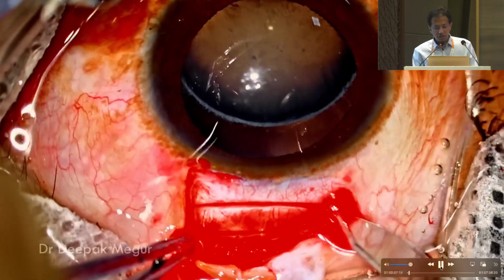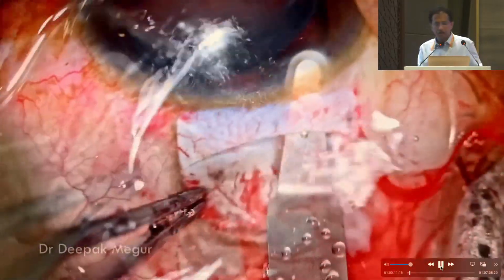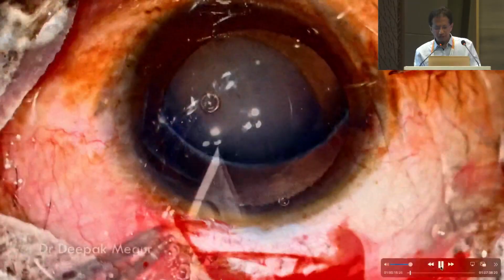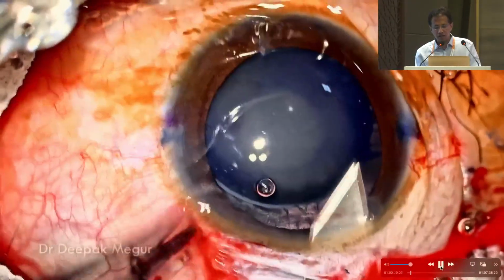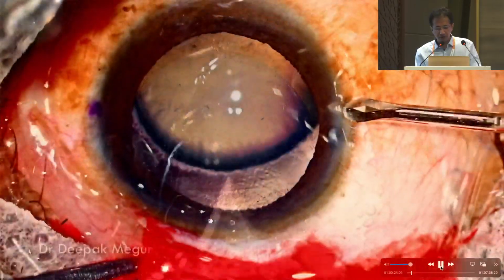Now, this is a young patient. He's around 35 years old. He has a gross subluxated lens and also microspherophakia. I don't find much advantage in trying to save the bag and fix the bag. In this case, I have decided to do an iris fixated lens. I'm going to sacrifice the bag.